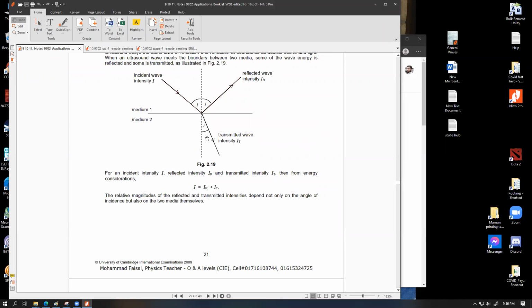As a result, because of using that gel, at the entry, the reflection would be very weak, which means most of the sent energy from the piezoelectric transducer, the silica crystal, would be entering the body. That's essentially what we are after. Or in other words, that gel would practically work like a thicker human skin.